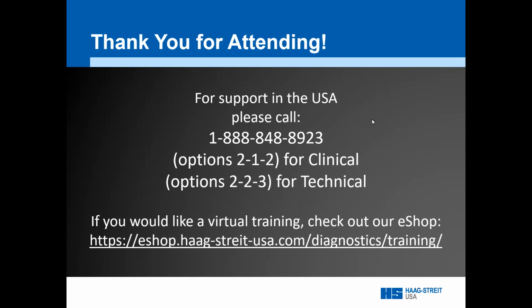Myopia management is becoming popular. Any specific tips on working with small kids? They're pretty challenging. Yes. So there are a couple tips that I have for working with children. We've had some feedback so far that having them stand up, and a Lenstar table actually has a pretty good range of motion. So it can go pretty low and pretty high depending on the height of your subject. But having a child stand up for a Lenstar reading will sometimes help keep them stable.